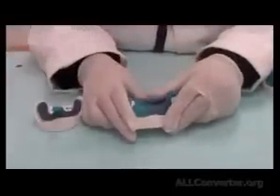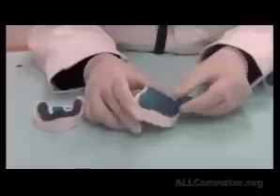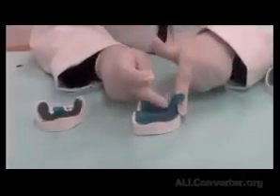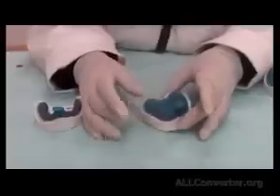If you want to revise the first step, which is border molding, we need to check that the space we have on the cast is true inside the patient's mouth. So once we have delivered the trays and we find that all of their features are all there, the body is smooth, the outline on the cast is 2 millimeters away from the sulcus, they have a sufficient handle, the handle is vertically inclined in the first part, and then it rotates to the outside so the dentist can hold it. So once I finalize the checking of the lab work, I approve this to be done in the patient, and then the patient comes in.